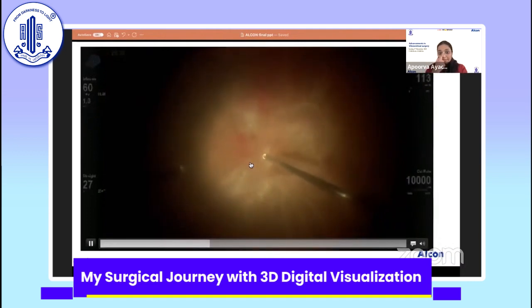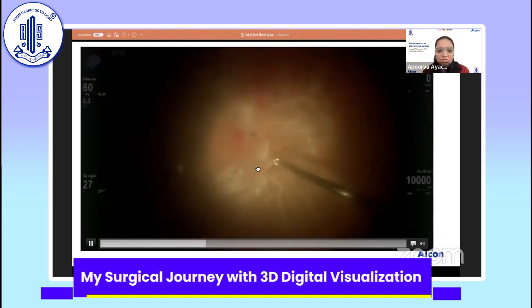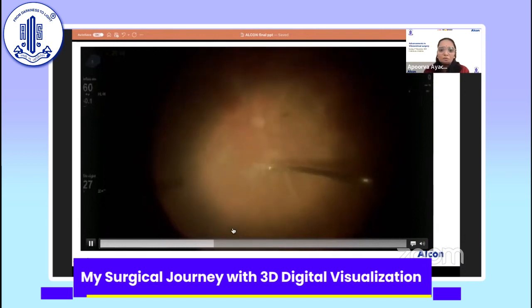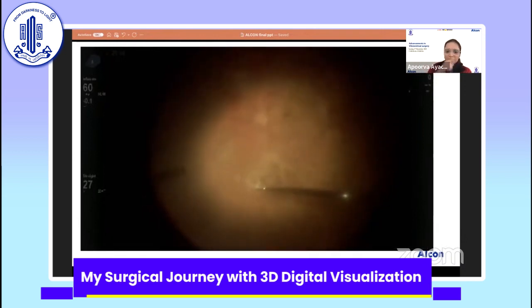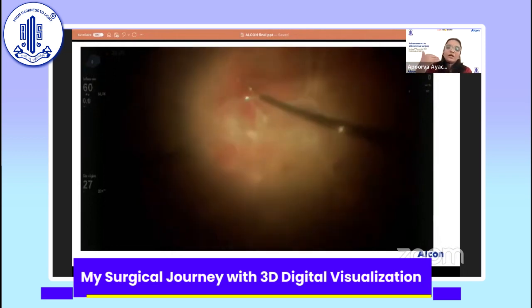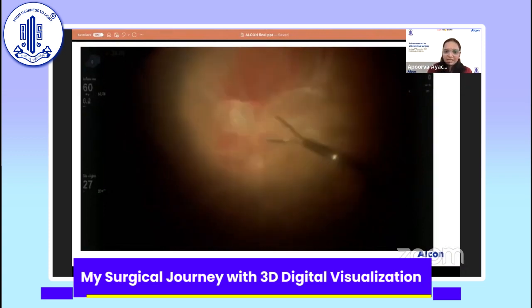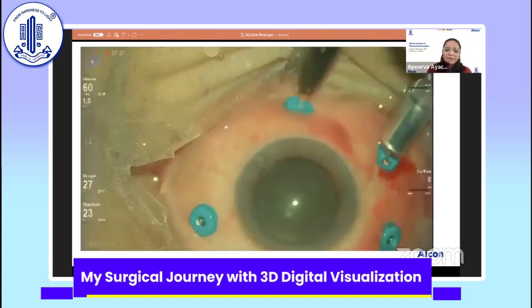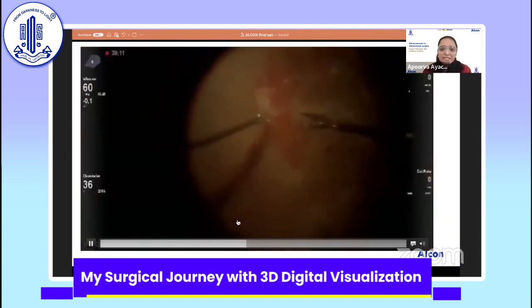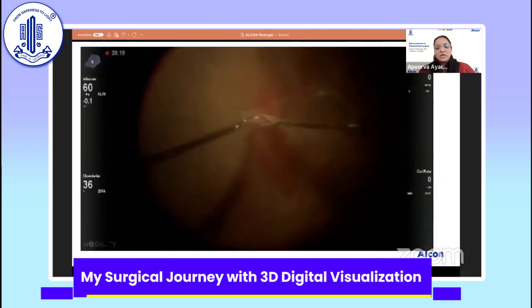So this is where my focality comes in handy, because when I'm pulling at one point with my forceps, I have a good focus on other distant areas which are out of that plane, which are in front of or behind that plane. So I know the distant effects of my cutting and pulling in one plane. So visualization of this kind really comes in handy in such cases.